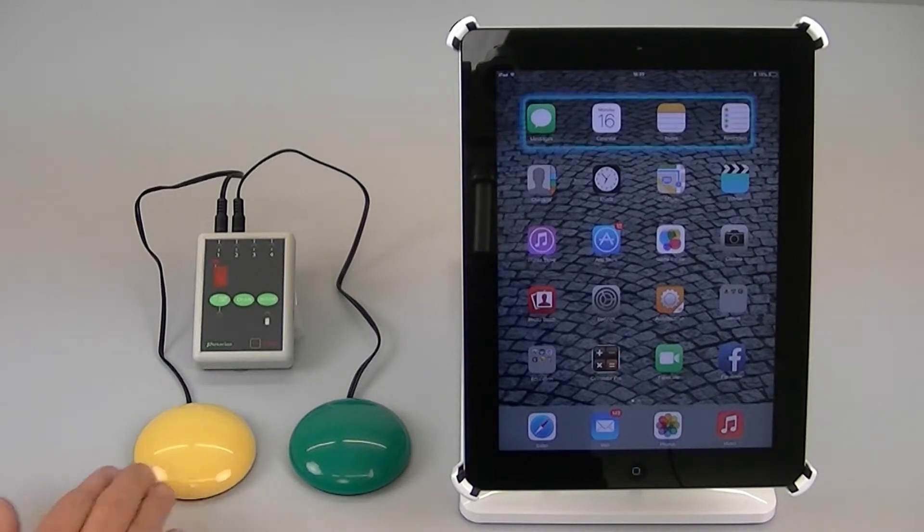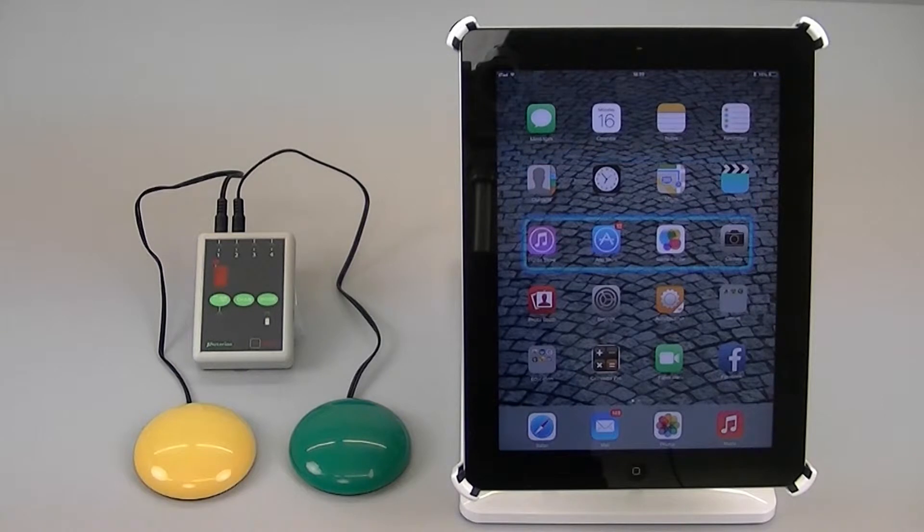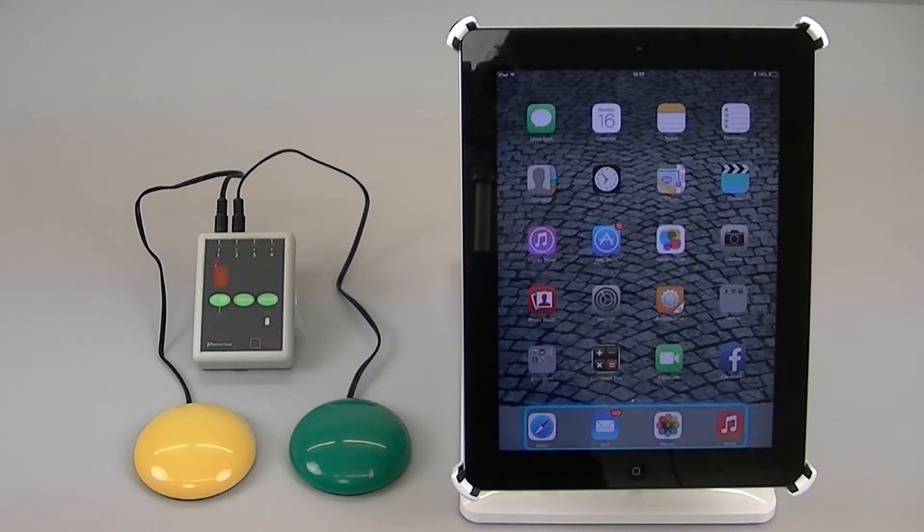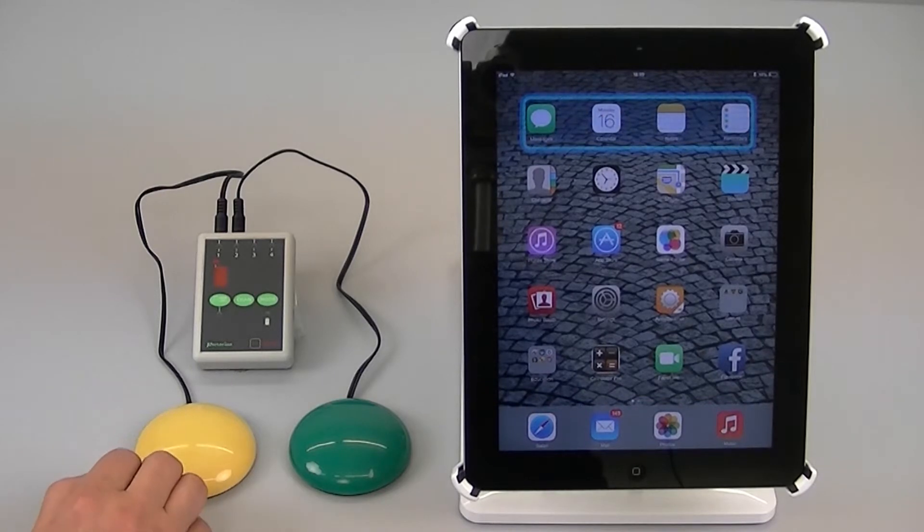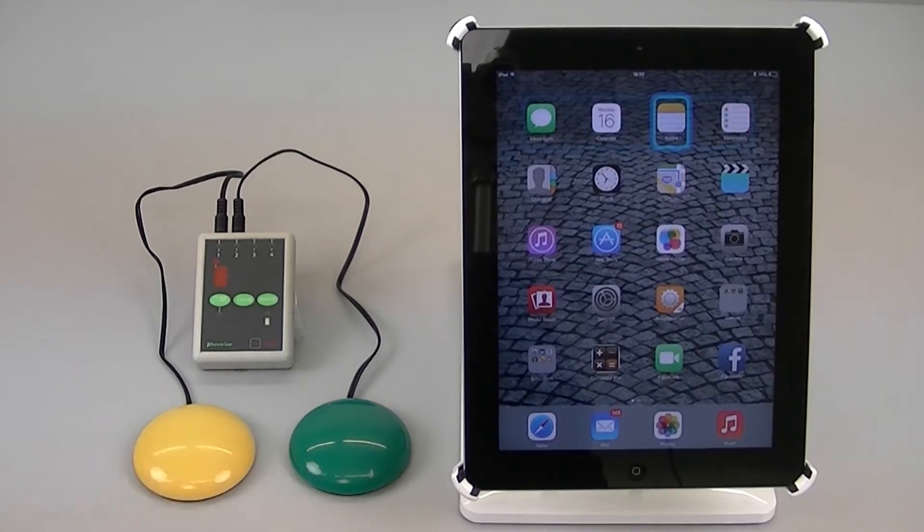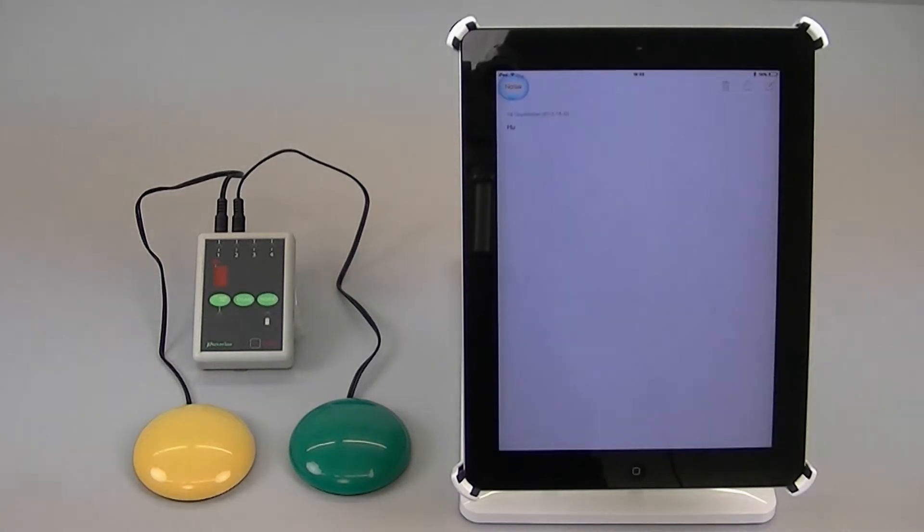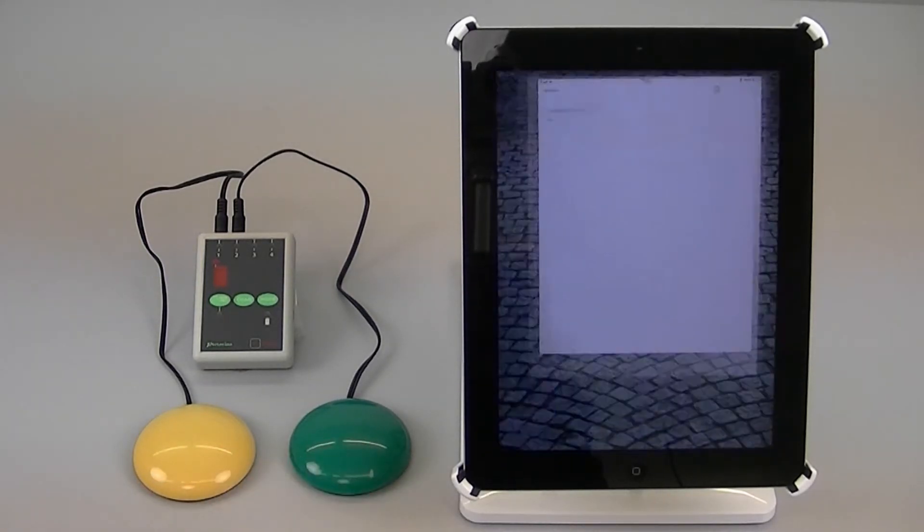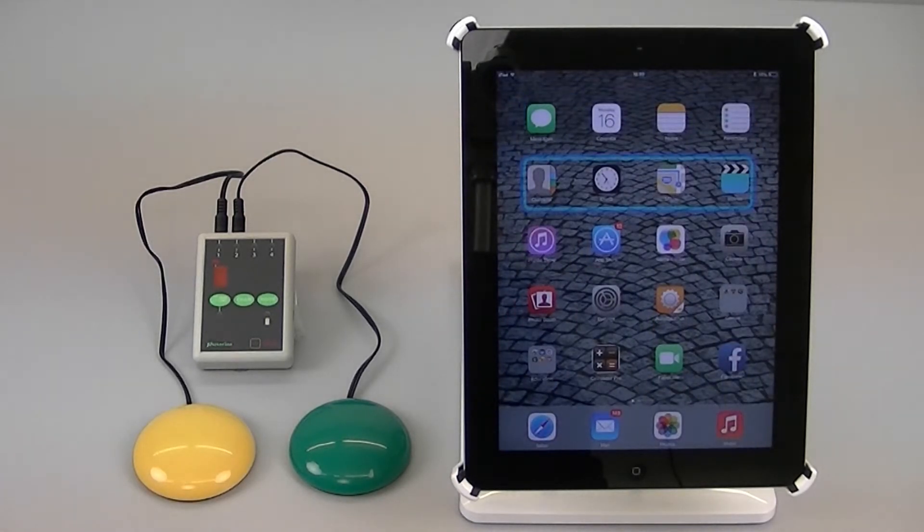So for example if I begin the scanning procedure and I go into a particular app, it doesn't really matter what, let's say notes. Then from within the app all I need to do is press the green switch and I automatically go back to the home screen.